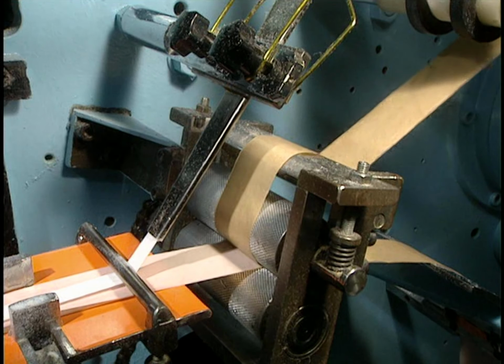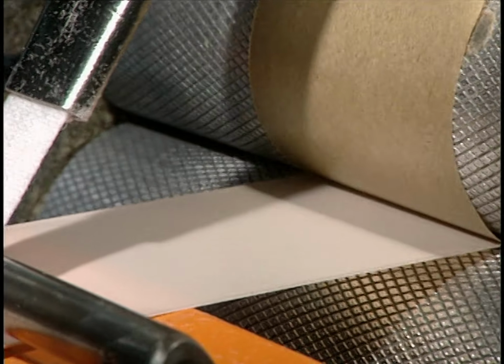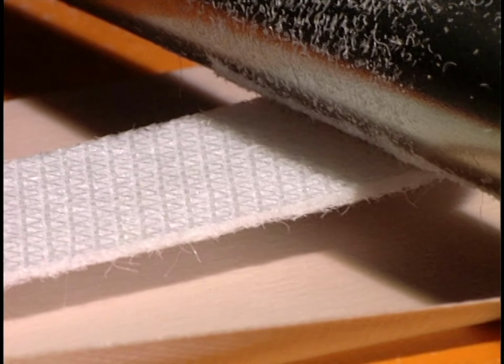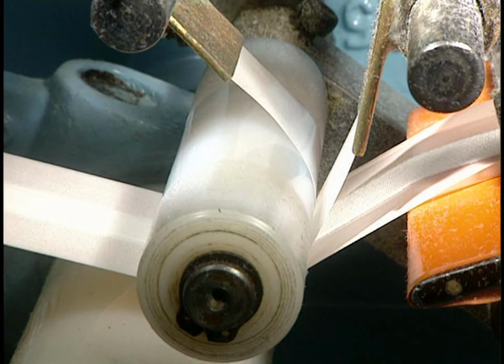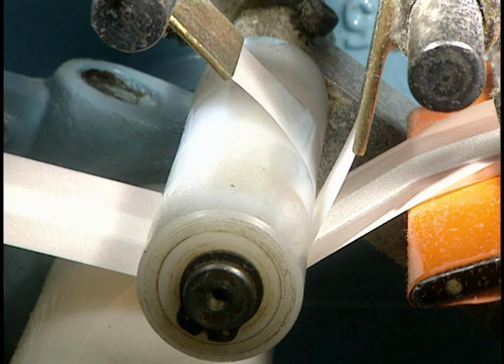Here we see other small bandages that are made in a different way. The cushion strip is positioned at the center of the ETS fabric strip. The cushion pad isn't sterile at this stage. They will have to be sterilized right at the end of the fabrication process. Next step, applying 2 plastic paper protectors over the glue-covered ends of the bandage.